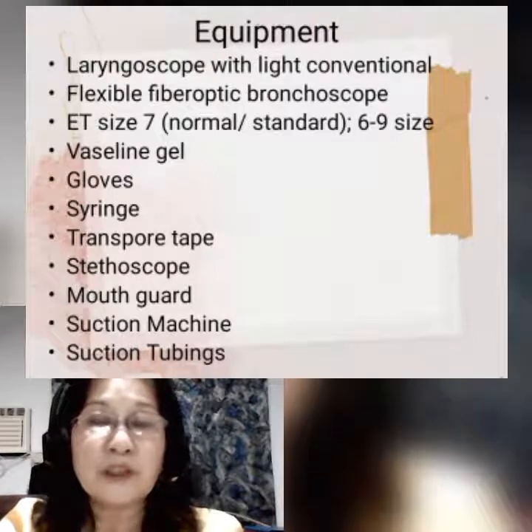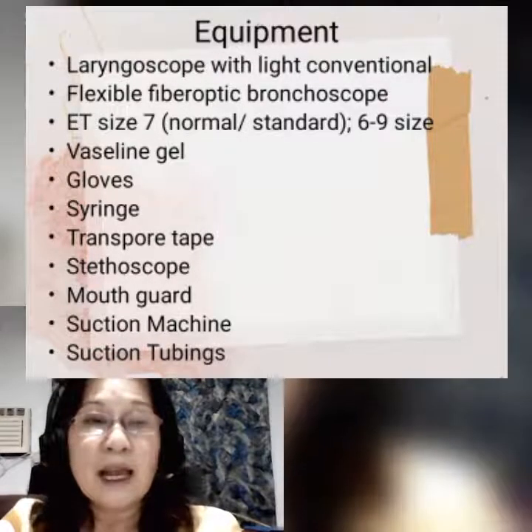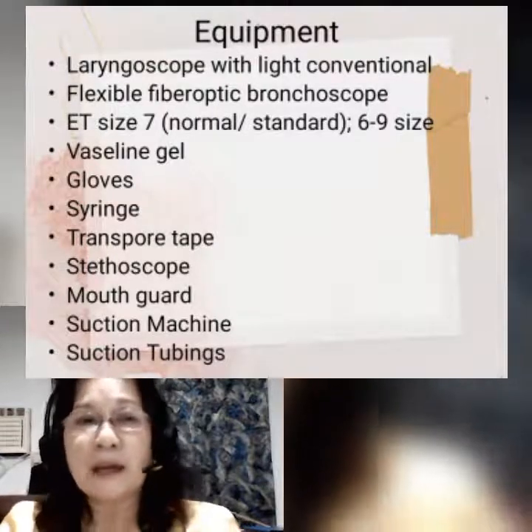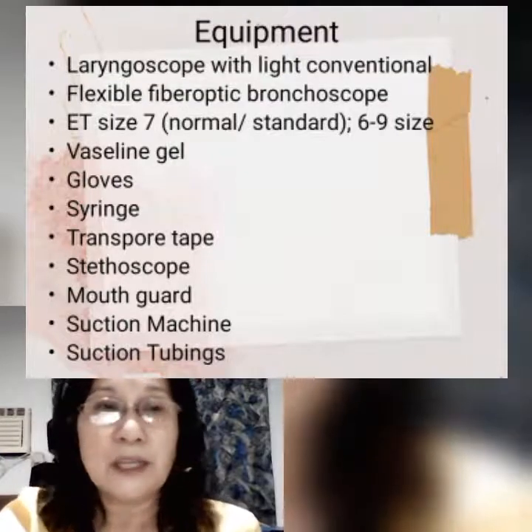Then, of course, your suction machine. So, suction machine should be at the bedside of the patients, and then suction tubing. So, the suction tubings will be either for oral suctioning and for ET suctioning.